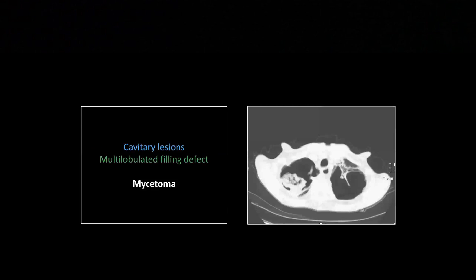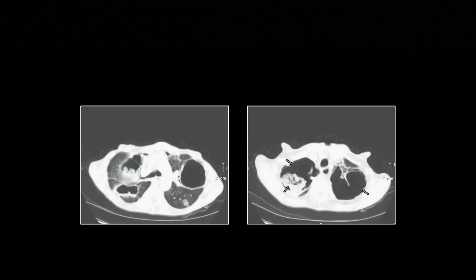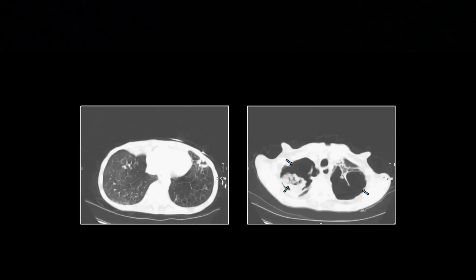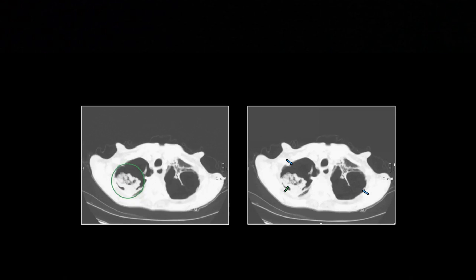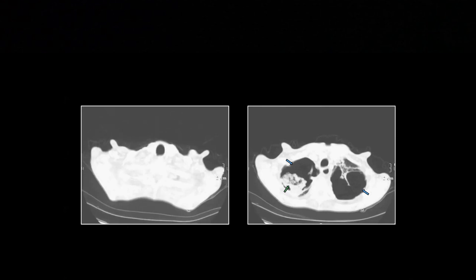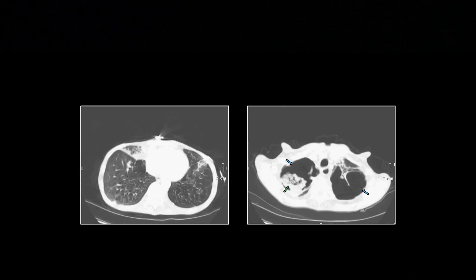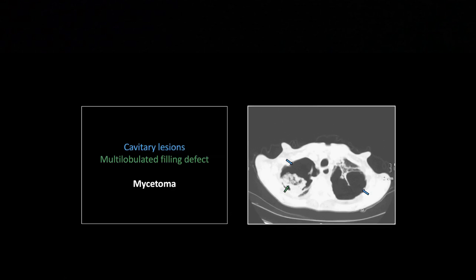This is one you don't see too often but everybody knows: extensive destruction in a tuberculosis patient. TB loves the upper lobes and can chronically cause this extent of cystic lung destruction. There is a hyperdense ball in the dependent aspect of this cavity — a classic mycetoma. In the old days you'd do prone positioning to see it move. This case also shows other cystic changes, bronchiectasis, and airspace disease. Typically Aspergillus is the fungus causing a mycetoma.